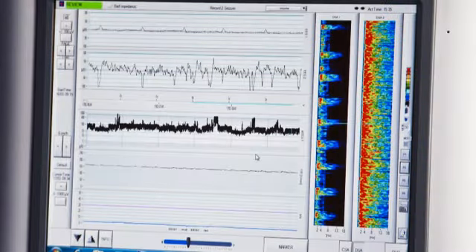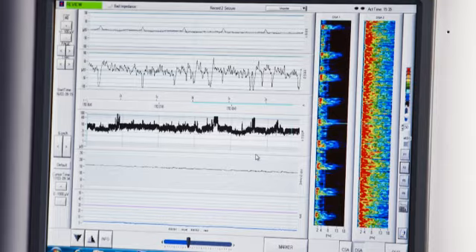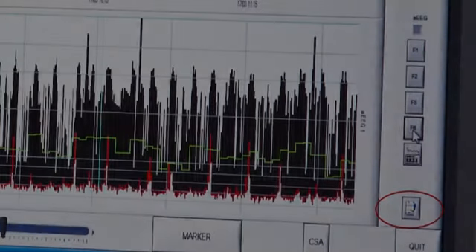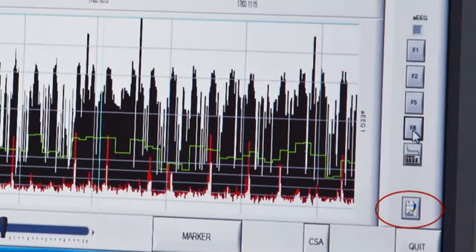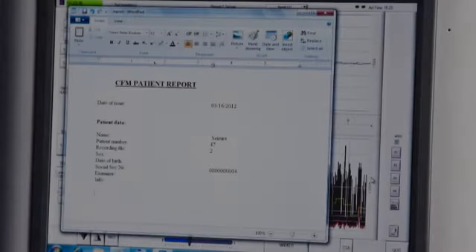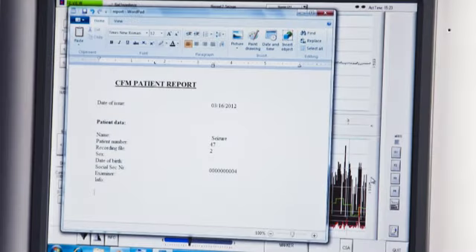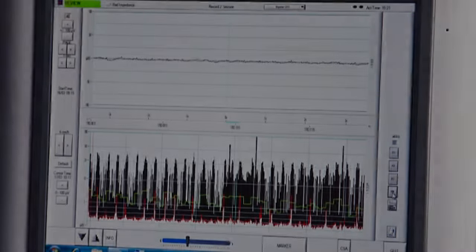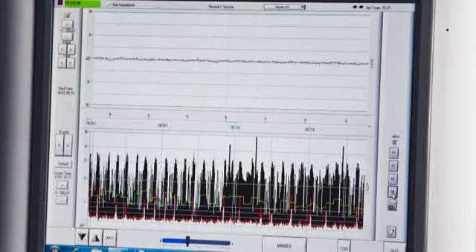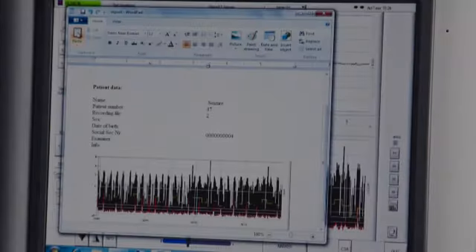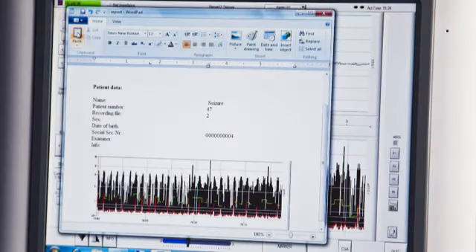Right click on the AEEG, EEG or spectral array to copy the trace. On a touch screen monitor, hold on the trace for a couple of seconds. This is equivalent to right clicking on a mouse. Paste it into the report and type up the patient notes.